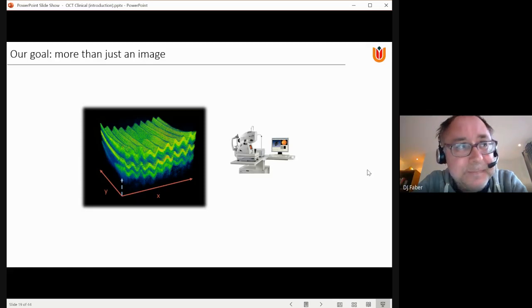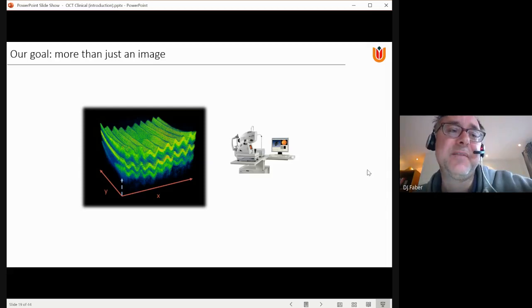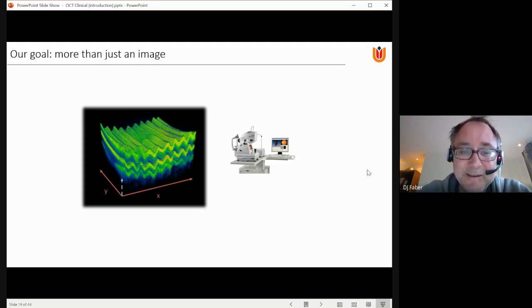Well, they still breathe, and there is still a heartbeat. So asking someone to sit still actually works quite well. Even within 3 seconds, that would work. They can even hold their breath for 3 seconds, even if you consider that they are mostly older people. That still works. But the heartbeat is something that you can't just suppress.